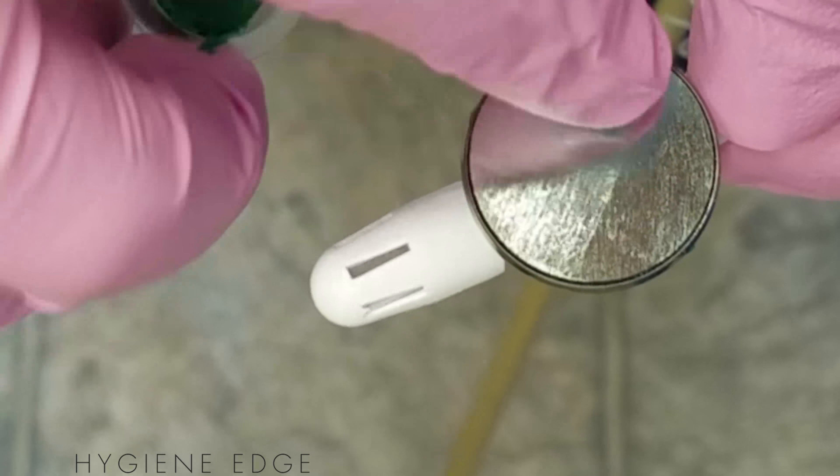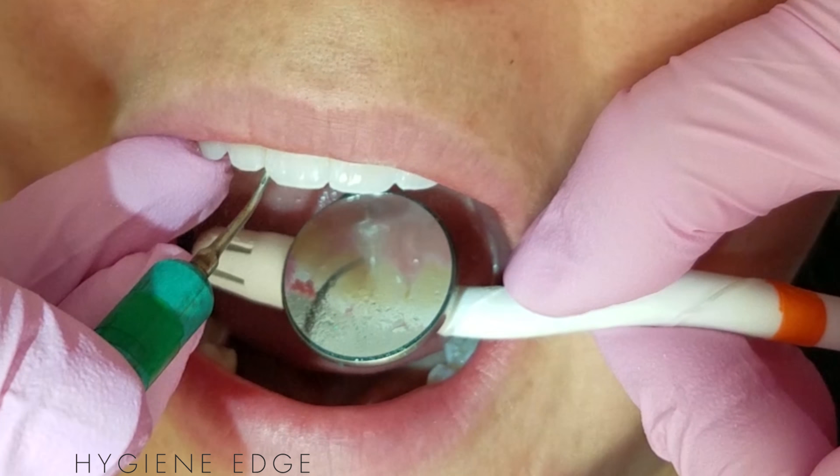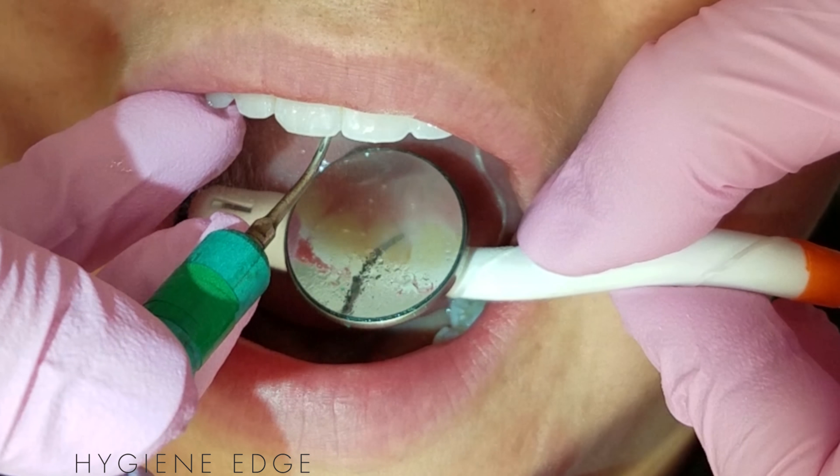If you notice that water keeps beading up on it, you can rub a little prophy paste on the durable and really bright titanium mirror to reduce the water droplet surface tension. It won't damage it.